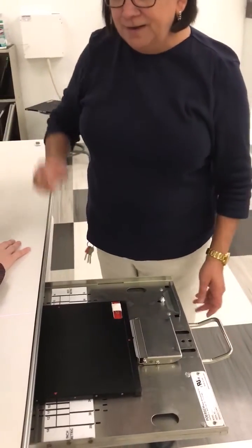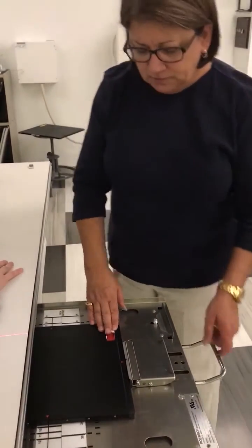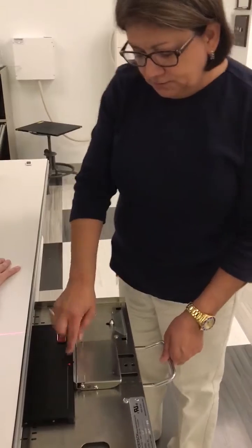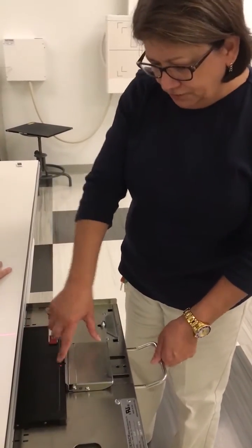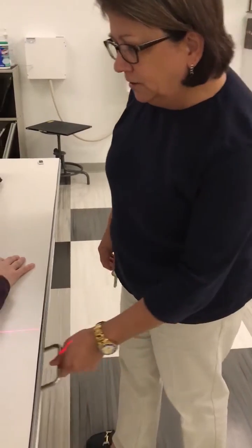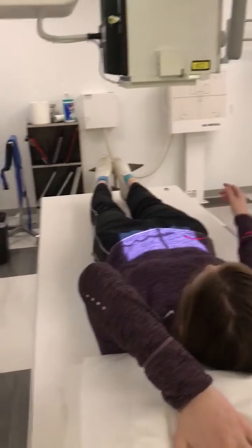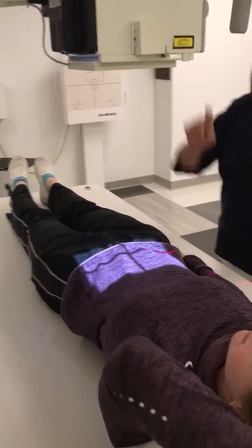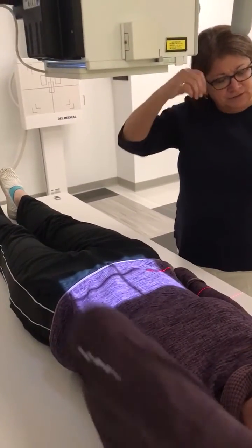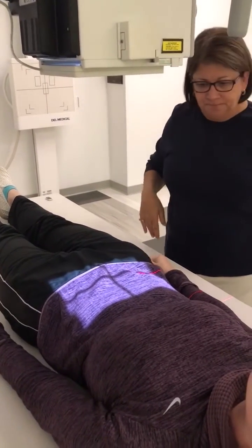So for our nephrogram, we're using the 10 by 12 IR crosswise, centering our IR to our central ray, making sure the IR is centered in the bucky. Close that bucky tray. It did collimate that time, didn't it? Yeah, but she's already at the 40. Oh. So I wonder if my SID was decreased, if it would have.